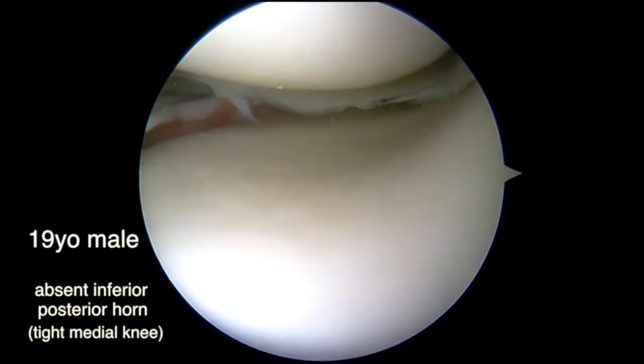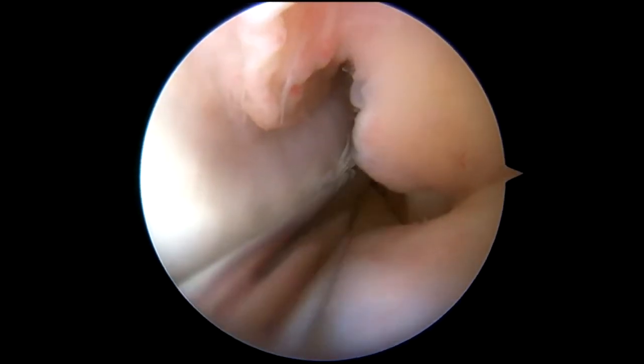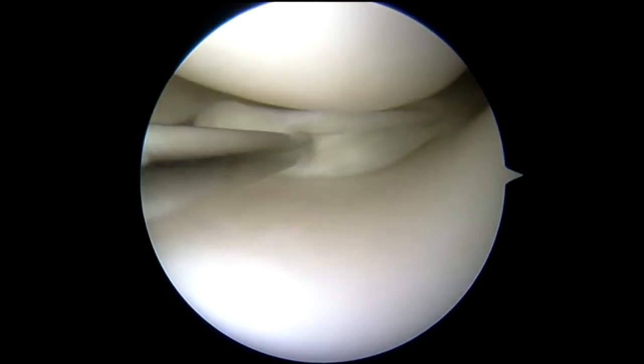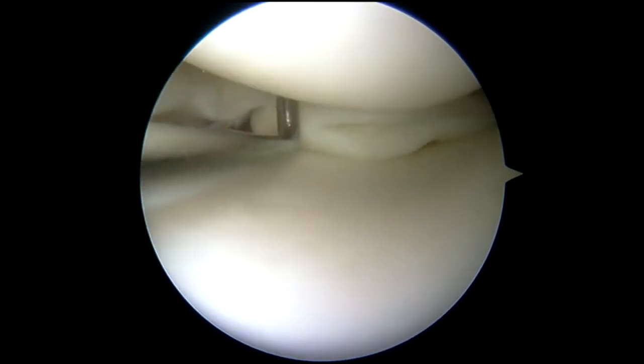The next case is a 19-year-old male who lost the posterior horn of his meniscus, and I found it in the posterior notch. This fragment was pulled down, and you can see how it's lost its normal shape. It would be really easy to remove this meniscus, but he's 19, and this would have been a significant meniscectomy to remove this portion.